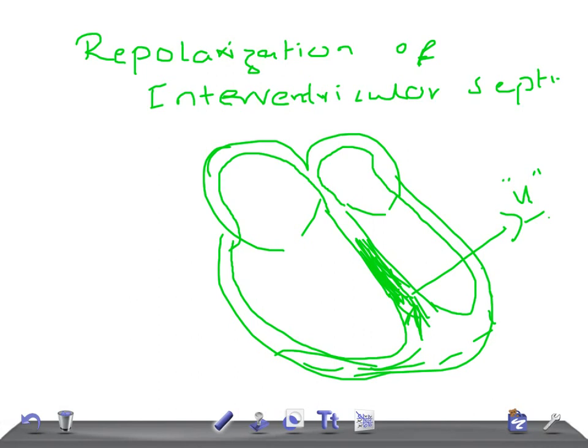The other point to remember is that U-waves are small, pointing in the same direction as the preceding T-wave. If the T-wave is positive, the U-wave will be positive. If the T-wave is inverted, the U-wave will be inverted.